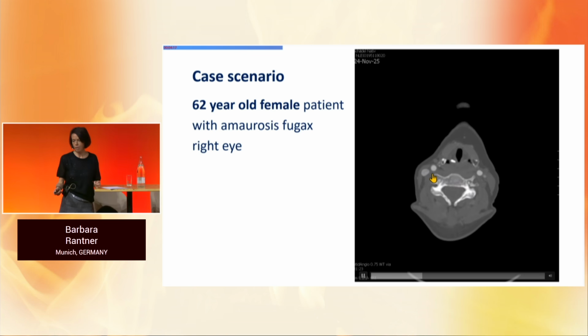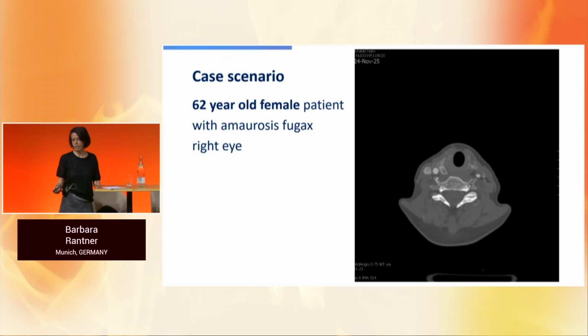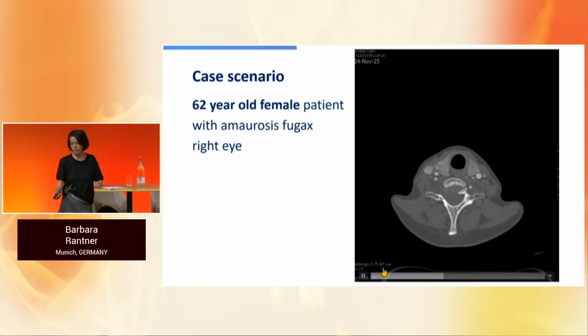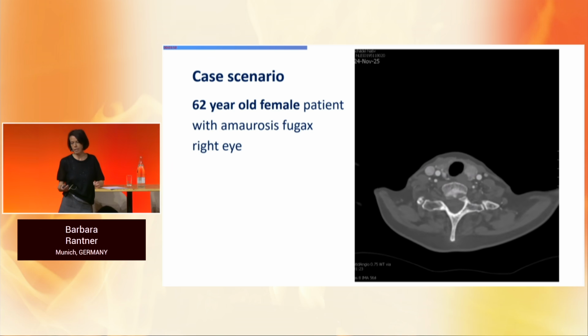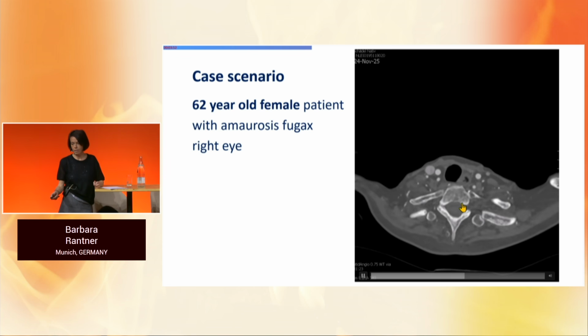You can see this perfusion deficit and the common carotid still with some calcium. Going further down, we will see two other lesions, this one right here, and also at the origin of the common carotid in the innominate and also in the aortic arch.